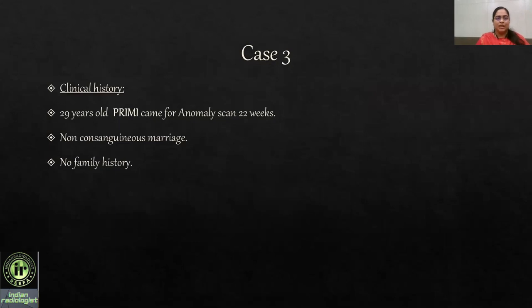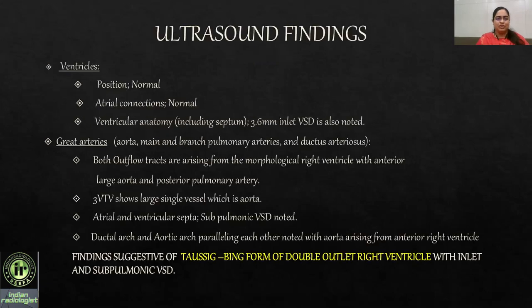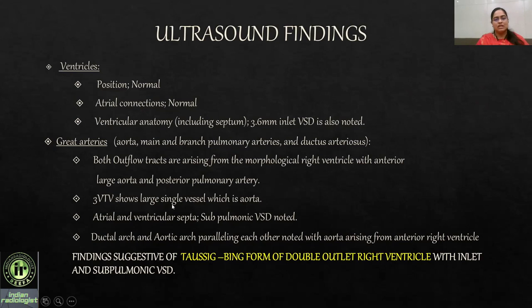Case 3: A 29-year-old primigravida came at 22 weeks for an anomaly scan. Non-consanguineous marriage, no family history. The position of the ventricles was normal with normal atrial connections. Ventricular anatomy showed a 3.6 mm inlet VSD. Both outflow tracts were seen arising from the morphological right ventricle with an anterior large aorta and posterior pulmonary artery. On three-vessel trachea view, a single large vessel — the aorta — was seen. A sub-pulmonic VSD was also identified. Ductal and aortic arches were paralleling, suggesting a Taussig-Bing form of double outlet right ventricle with sub-pulmonic and inlet VSD.